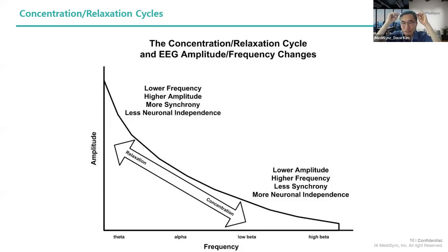Also, our skull usually cannot transmit high frequency. The higher the frequency, the lower the permeability of the high frequency activity, and the high frequency activity drops rapidly. Combining these two effects, high frequency activity usually has very small amplitude. This is the amplitude and frequency relation.